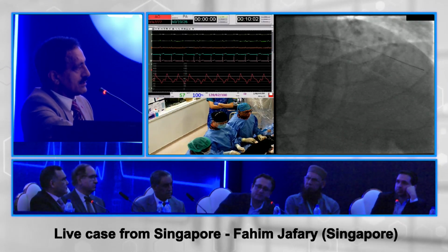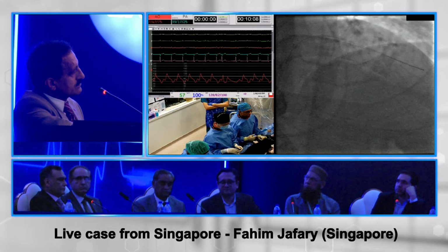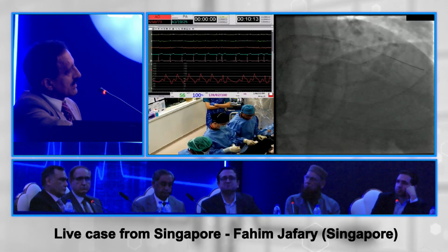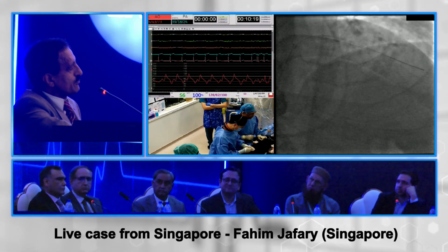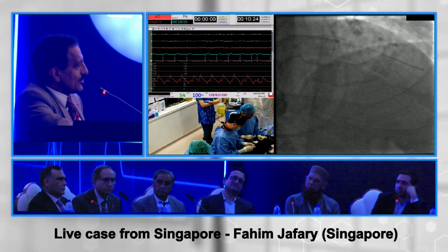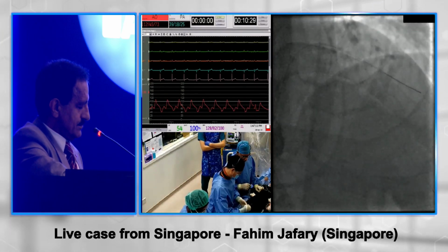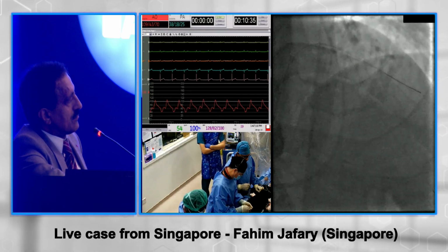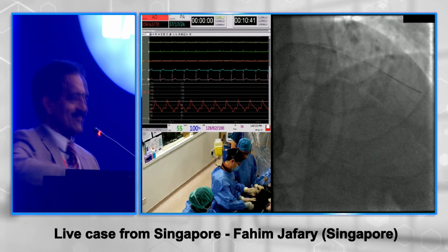At the end of the day, I'm not sure how much of a prognostic benefit there is, but it is a big diagonal, so we felt it would be reasonable to at least open this up with a balloon. My only concern is it's a diffusely diseased vessel. If you're not planning to stent and just doing balloon, with dissection and all those problems, going back into that diagonal may be a problem. Well, we're also going to do a DCB, so we're going one step in between nothing and a stent. In the hands of my partner, who's one of the world experts in DCB, hopefully this will be okay. Point taken.